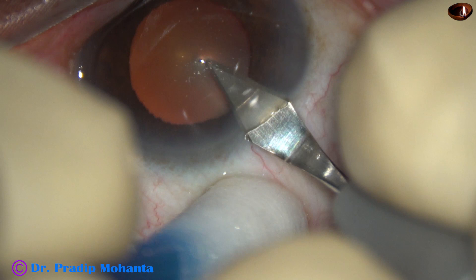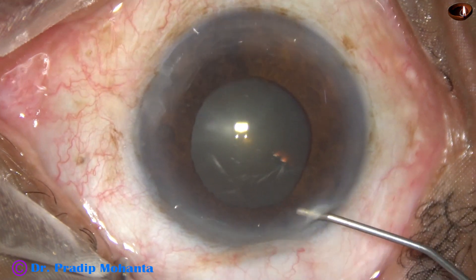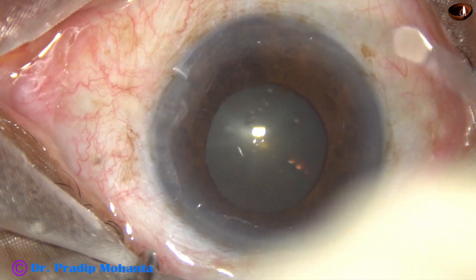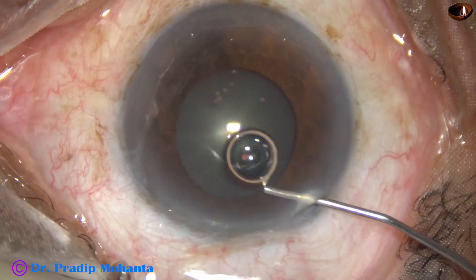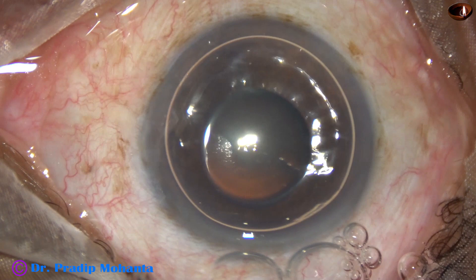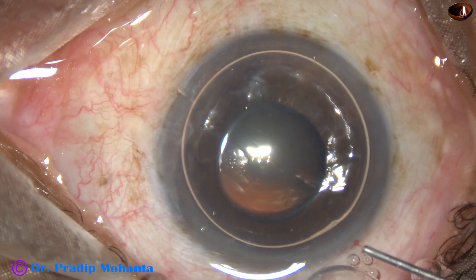This is the main incision with a 2.8 mm steel keratome on the posterior aspect of the limbus. This is phenocaine containing tropicamide, phenylephrine, and lignocaine. The patient is under topical anesthesia. A few drops of proparacaine has been applied over the ocular surface.